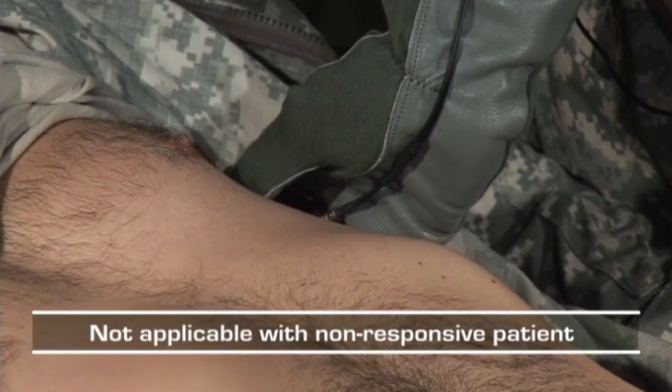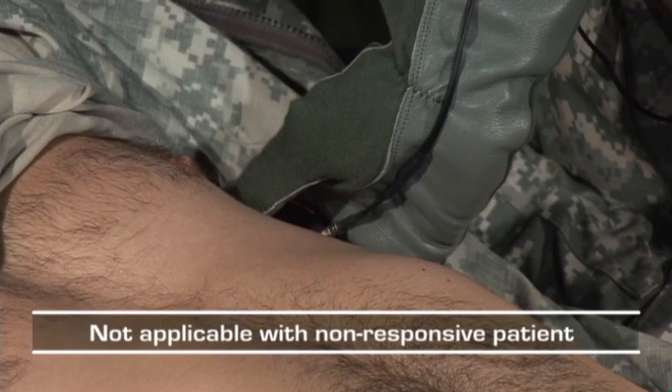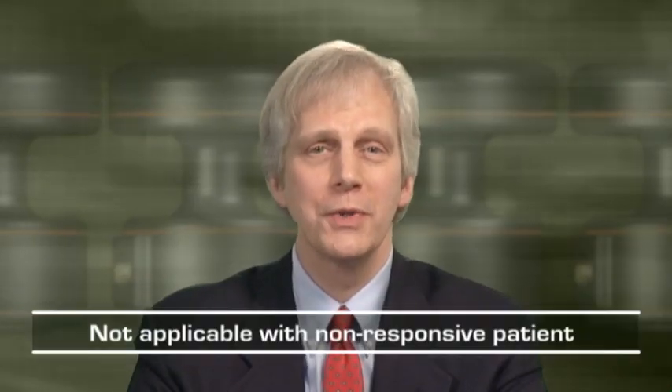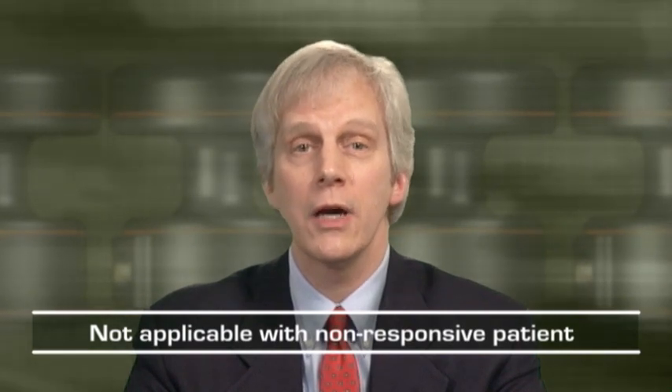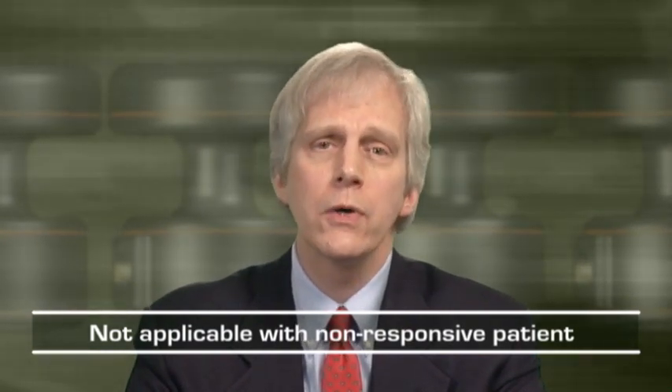If the patient is conscious and can obey commands, ask them to take deep breaths. It can also be useful to get them to hold their breath to reassure yourself that the sounds are coming from lung wall motion as opposed to movement of the device. Normal breath sounds with the Doppler mode have been described by clinicians as resembling a coarse friction rub or bronchial type breath sounds.